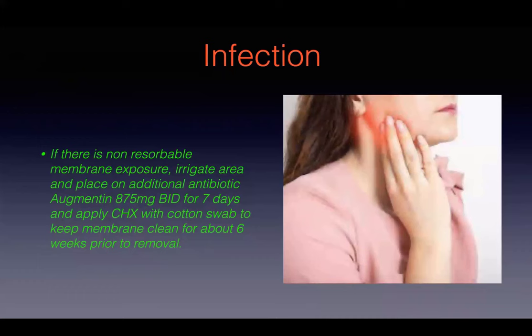Jennifer, I get my membrane tacks from Salvin Dental. And they also sell the screws too, the Profix. For the socket preservation, what kind of bone graft do you mostly use?